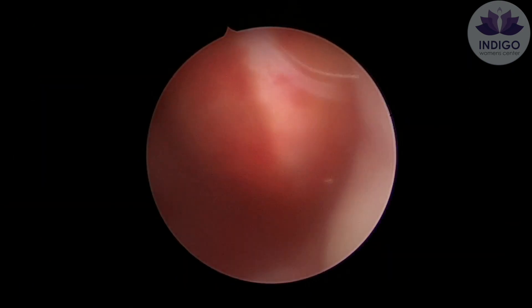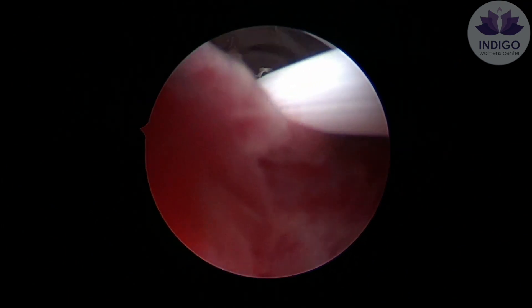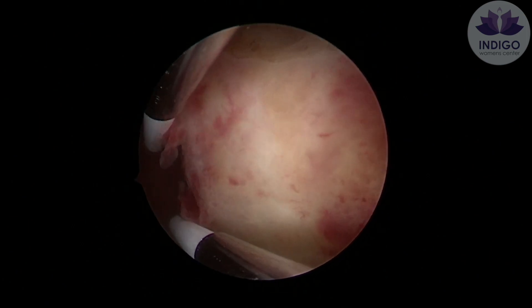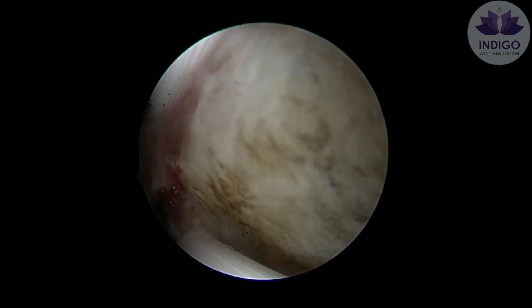To perform this procedure, always start from beyond the fibroid and slowly resect it towards you while pressing the foot pedal activator. At the same time, also draw your blade in and press it down. This way, you will be able to effectively scoop out parts of the fibroid.